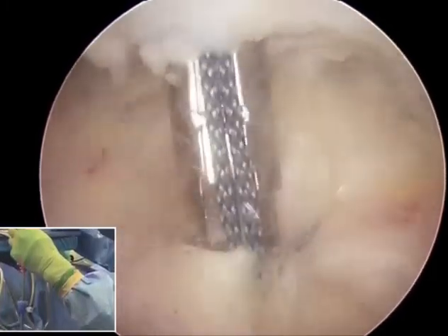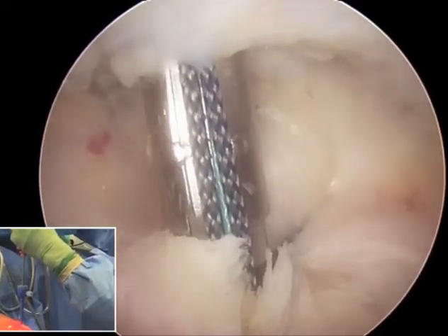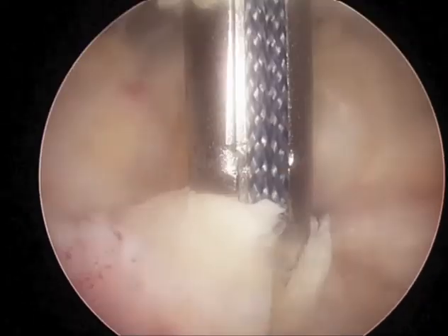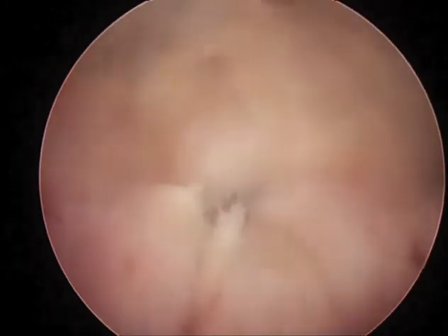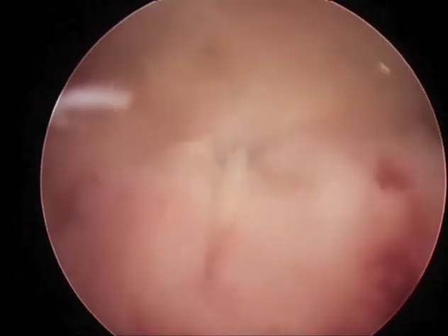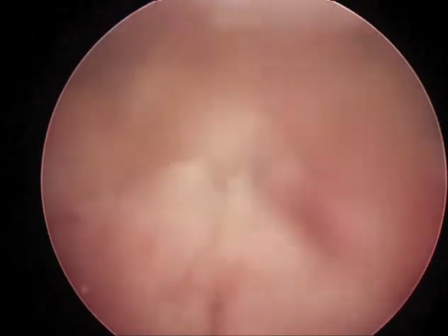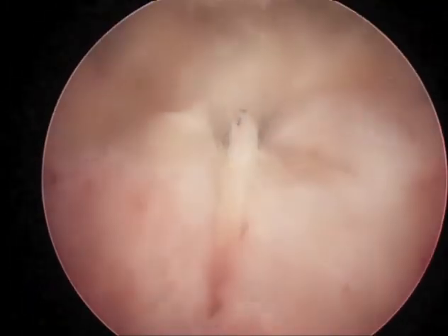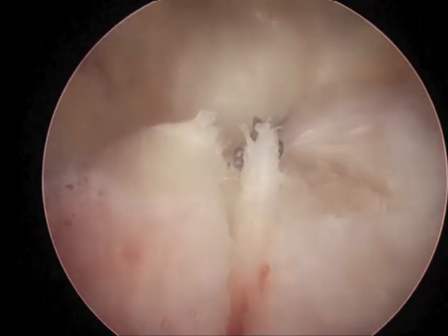As the anchor is seated fully, we remove the retaining stitch and then tension each suture individually to create a satisfactorily stable repair. The sutures are cut, the elbow is flexed and extended to make sure we have a good solid repair, as seen here in full range of motion of the elbow. This completes the arthroscopic repair of the triceps tendon tear.